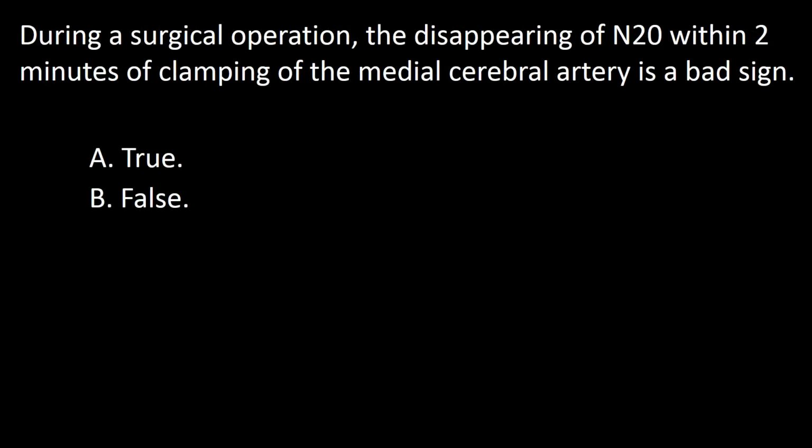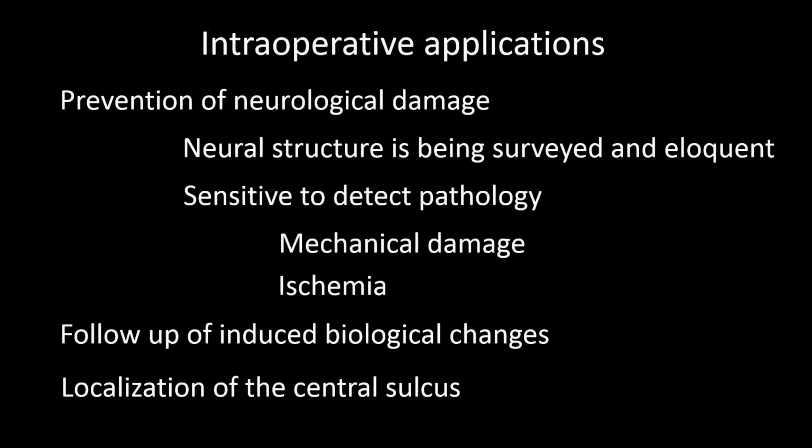Next question. During a surgical operation, the disappearance of N20 within 2 minutes of clamping the middle cerebral artery is a bad sign. A true, B false. One of the applications of intraoperative monitoring is following induced biological changes. One of these biological changes is ischemia.